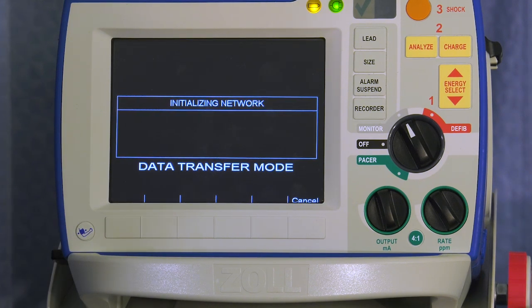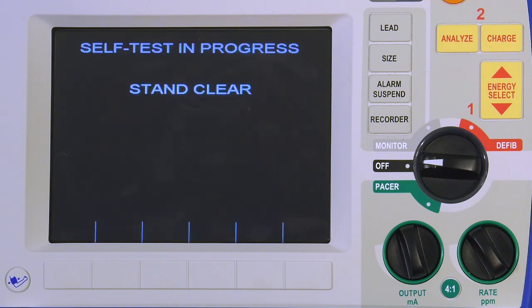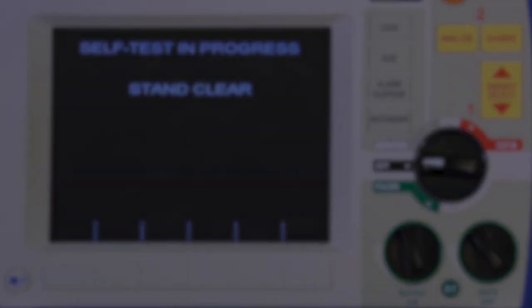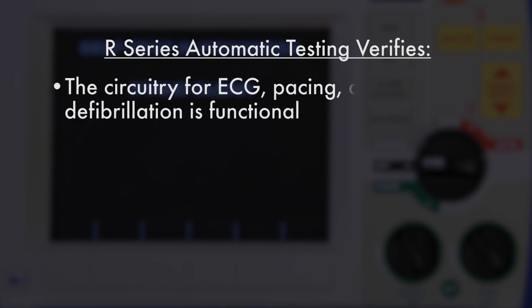The R Series maintains a constant state of clinical readiness by offering a daily automatic test. Testing will occur while the one-step cable is connected to one-step electrodes, paddles, or the test port located on the side of the defibrillator. The R Series automatic testing verifies that the circuitry for ECG, pacing, and defibrillation is functional.